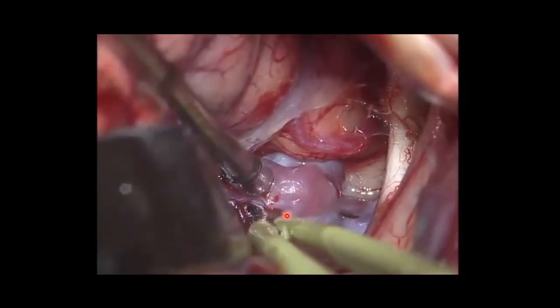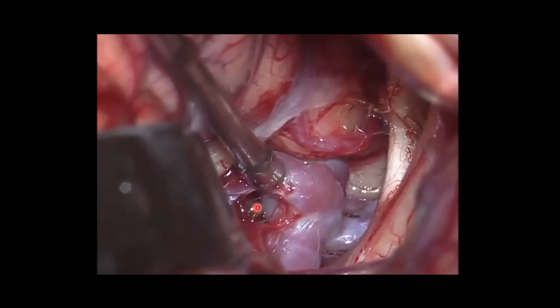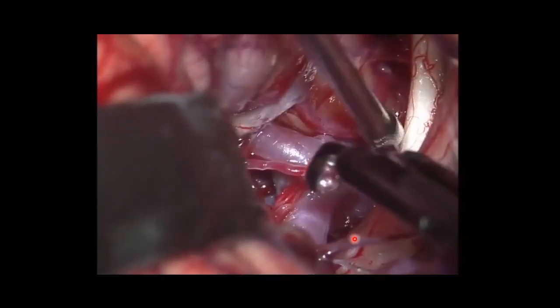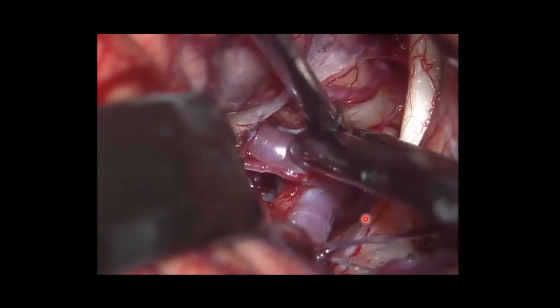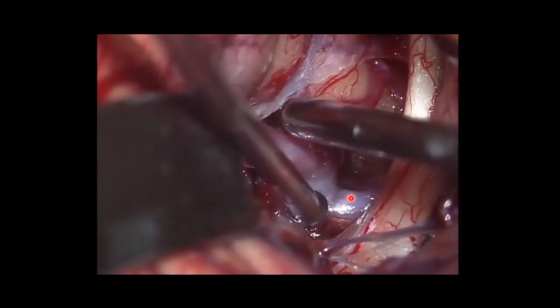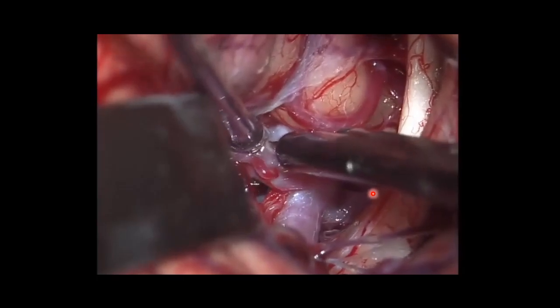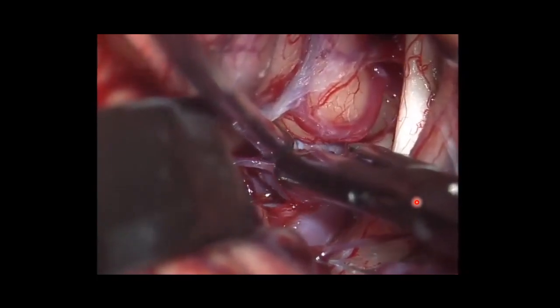Now he's dissecting. The aneurysm is pointing anteriorly on the angiogram, so it will be pointing superiorly here in surgery. Now this is left A1. Now he's clipping the aneurysm. The left A2 is down here. He's using a curved clip.